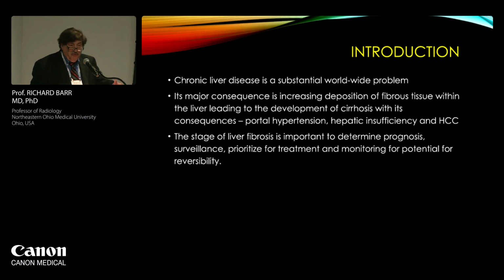And again, what do we want to do? We want to be able to stage these people because it's really important to know prognosis and surveillance. We now know that if we treat the underlying condition, we can see reversal of fibrosis and surely of fat. So again, we need a technique that we can do over time. Biopsy obviously is not something that we're going to get patients to volunteer for every 6 months. MR is a little expensive, so really ultrasound is going to play a very key role in evaluating these chronic liver diseases as we have these treatments and we can see reversals of the disease.